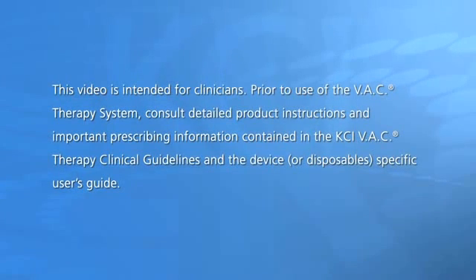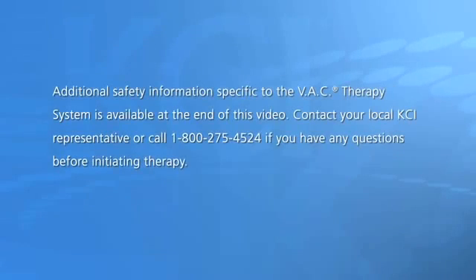Prior to use of the VAC therapy system, consult detailed product instructions and important prescribing information contained in the KCI VAC therapy clinical guidelines and the device or disposables specific user's guide. Additional safety information specific to the VAC therapy system is available at the end of this video. Contact your local KCI representative or call 1-800-275-4524 if you have any questions before initiating therapy.